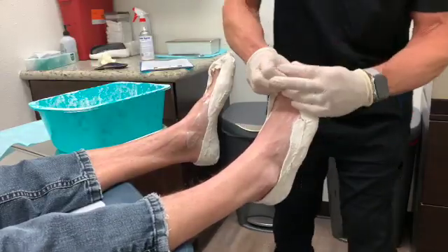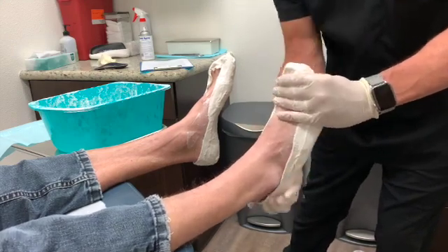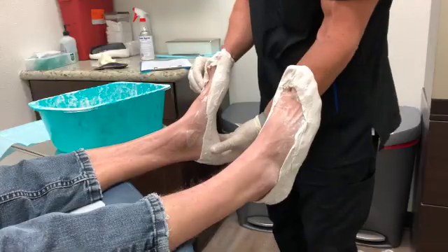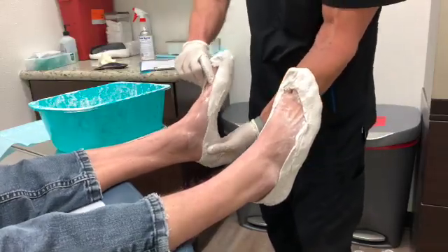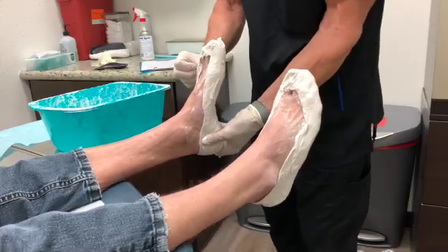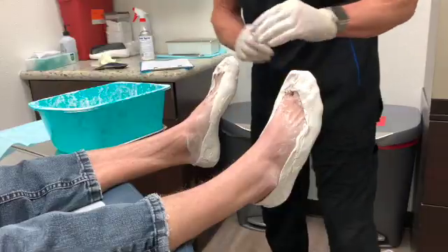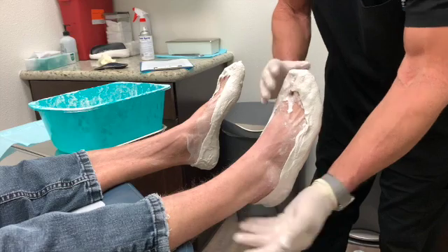What happens next is they're manufactured in a facility where they have a top cover added, and they've told me these devices never wear out, so a lot of my athletes wear them. Supination is a locked foot; this is an unlocked foot. We cast the patient in the neutral level where the whole leg is locked up and the foot doesn't move or go to the side — that's where we keep the patient neutral. He can also switch these from shoe to shoe.